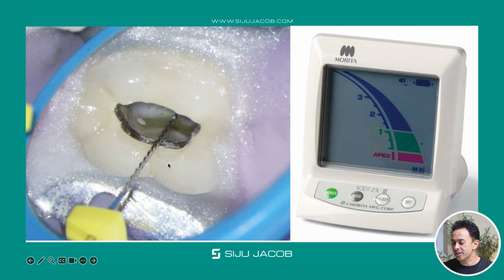So if you have a metal surface that is exposed, whether it's from a metal ceramic crown or a silver amalgam restoration, and the file that is going into the canal and is used for working length measurement touches this metal surface, then the apex locator can give variable results. It gives a reading as though it's already reached the apex, even when you are just in the coronal portion. So this is something that can give erratic readings and wrong readings. The apex locator is going to tell you that you've reached the apex when you've really just reached the coronal portion.